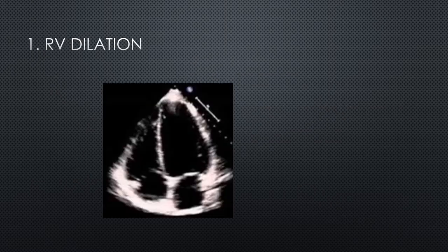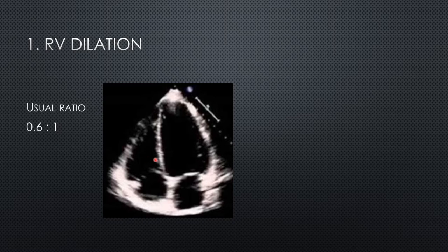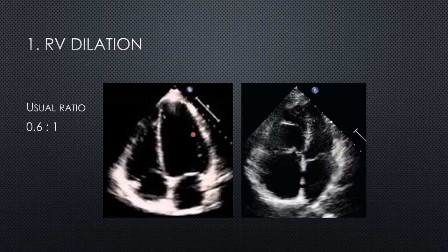The first of the core findings is RV dilation. In a normal apical four-chamber view, the RV should be 0.6 to 1 relative to the LV — so about 60% of the diameter of the LV. Here's an example of RV dilation where the RV is bigger than the LV — that's a severe RV dilation. As we said, RV dilation is not specific to PE; it can occur in lots of other conditions including chronic pulmonary hypertension.